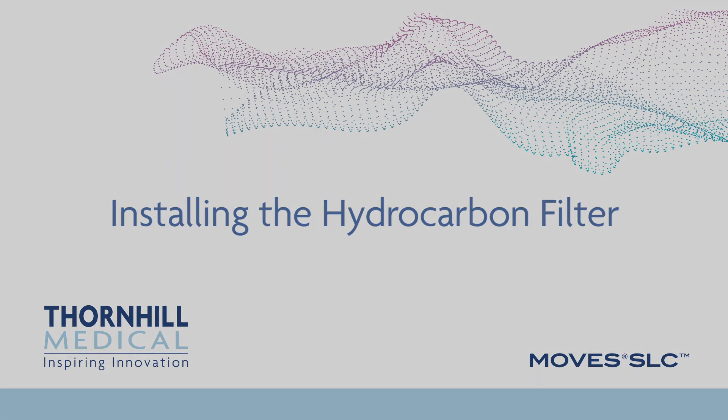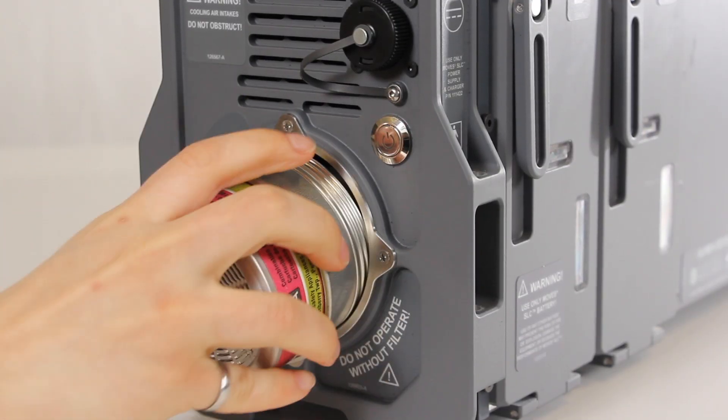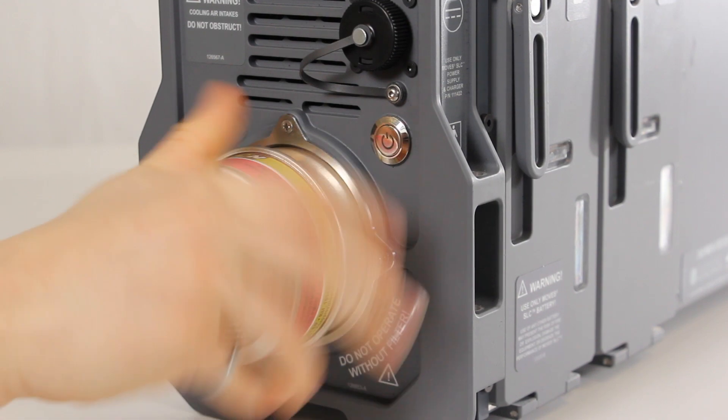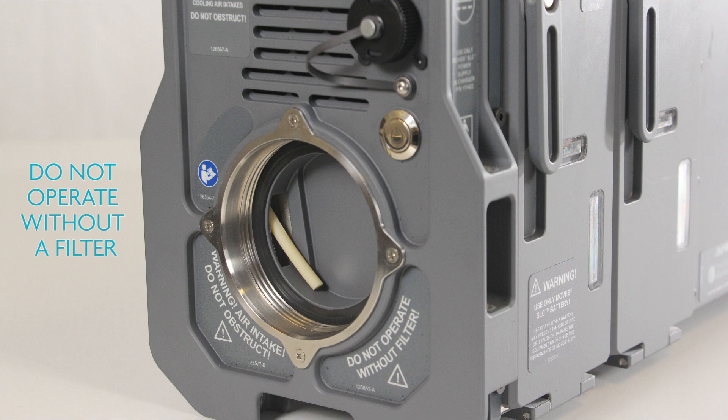Installing the hydrocarbon filter. Always install a hydrocarbon filter before powering up MOVES SLC. MOVES SLC will alert you with an intake filter blocked alarm if it becomes clogged. Insert the hydrocarbon filter into the rear panel of the MOVES SLC unit. Rotate the filter clockwise to install and counterclockwise to remove. The filter should be finger tightened. Have a hydrocarbon filter readily available for replacement purposes. If the hydrocarbon filter needs to be changed when the MOVES SLC is in operation, a replacement filter will need to be quickly inserted after the old one is removed. Operating MOVES SLC without a filter will damage the unit. Do not operate without a filter.